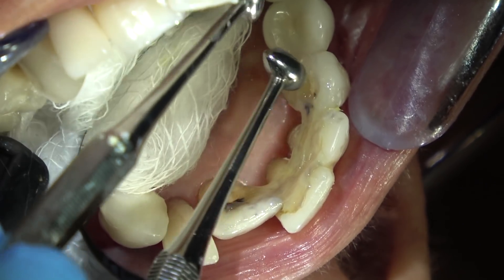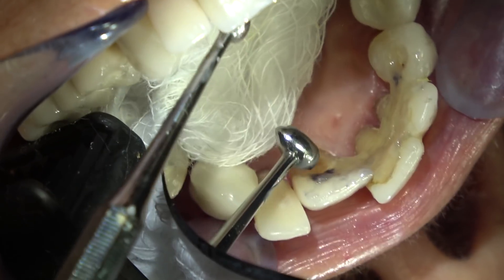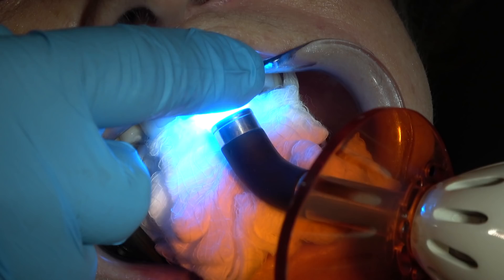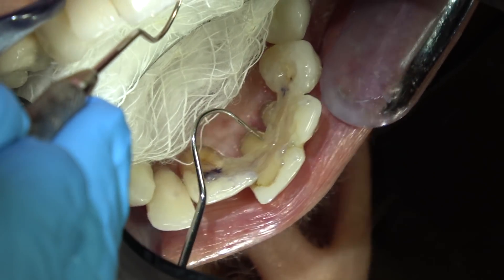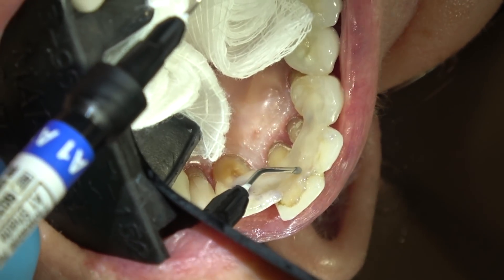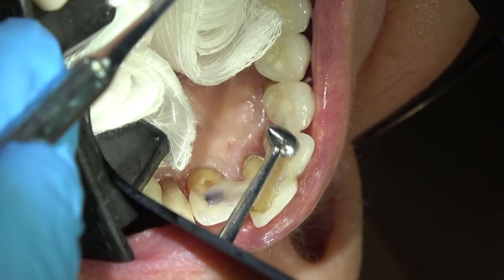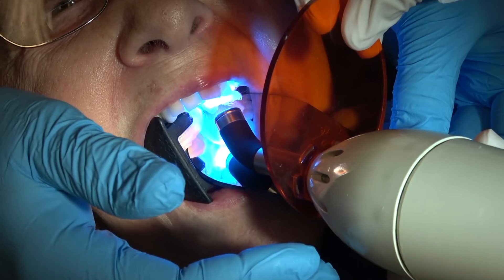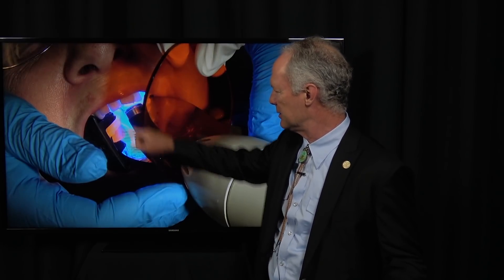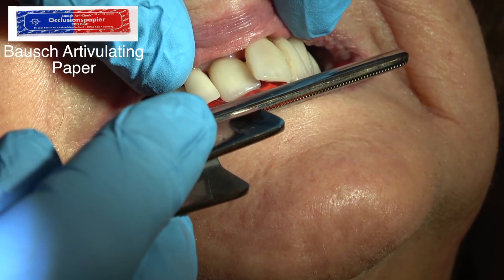I'm working the ribbon in, then removing any excess filled resin. Once it's in place, come back and cure it — I'm going to cure it for about 60 seconds in three or four different areas. I'm checking to see if there are any edges, and I'll come back and place some more filled resin on those edges, work it in with a ball burnisher, and cure that for 60 seconds each area. Now I'm going to check the occlusion.